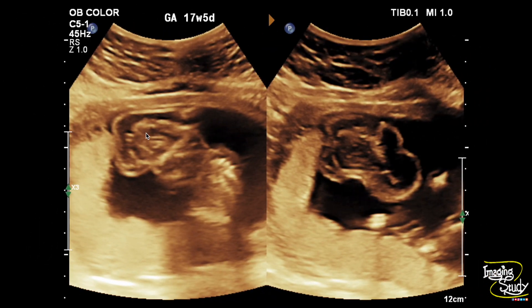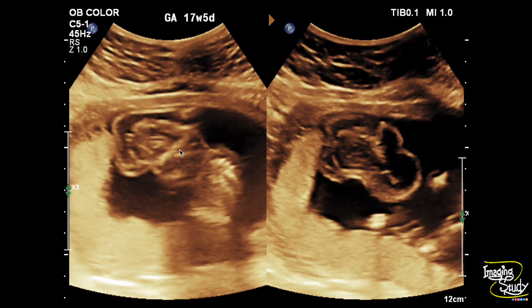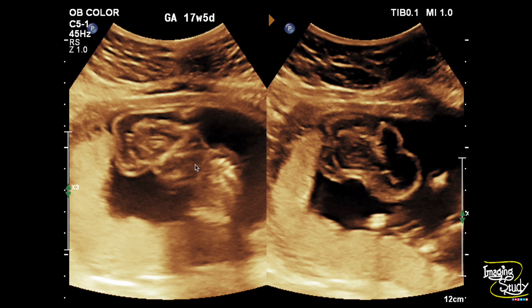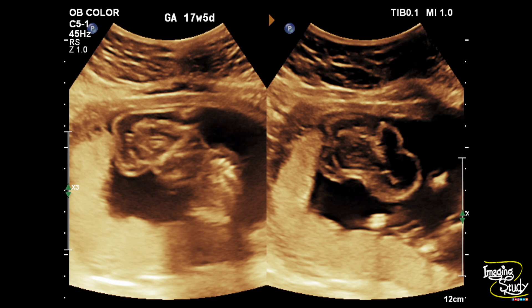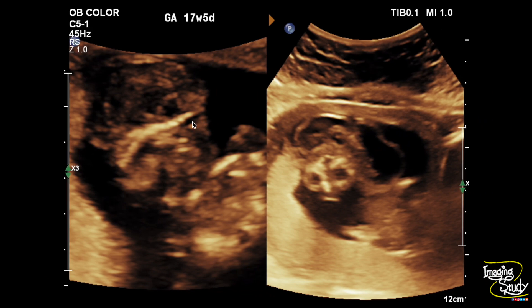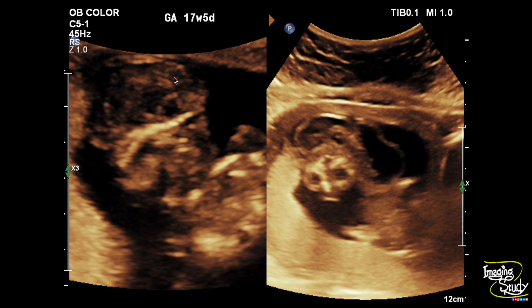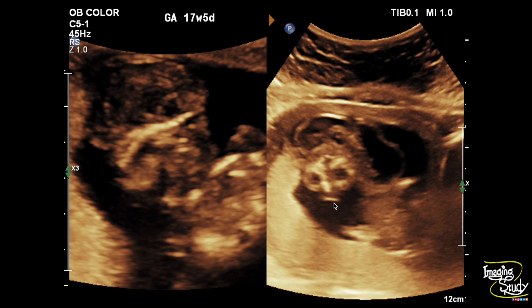Here is a picture of the complex cystic area having communication with the intracranial structure. Another picture — these are the scalp bones which are present, and adjacent to it you can see the complex cystic area in a magnified image.